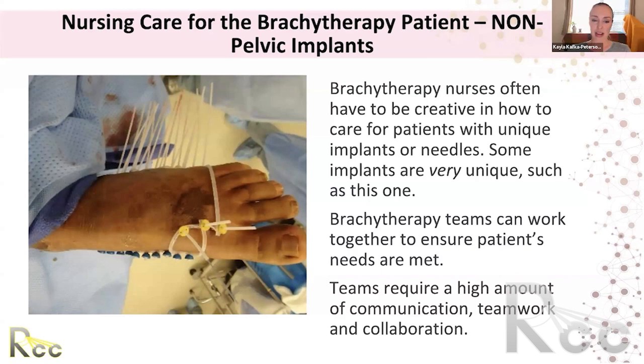Brachytherapy nurses often have to be very creative in how to care for patients with unique implants, such as this very unique implant, which was a 17-year-old who had a sarcoma in his foot. He refused amputation, which was the recommended treatment. So he got external beam with a brachytherapy boost. That was a really amazing implant done by Dr.